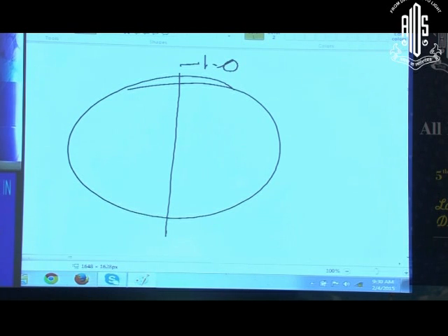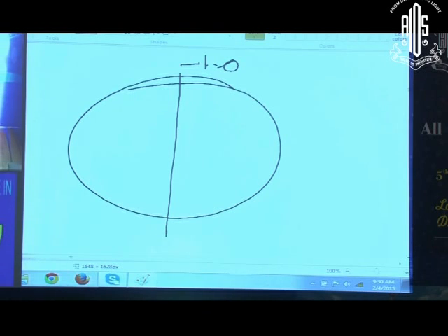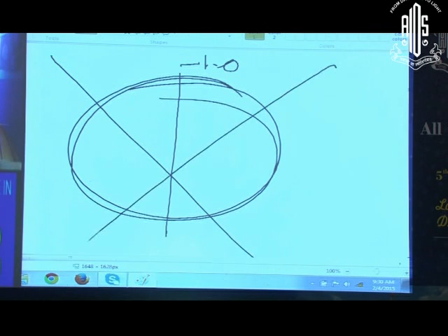So you put a cross cylinder in a way that the two axes of the cylinders straddle the test cylinder. So the test cylinder is 90. You straddle in such a way that one becomes 45, one becomes 135. That means equidistant from that. So this becomes minus 0.5 and this becomes plus 0.5.